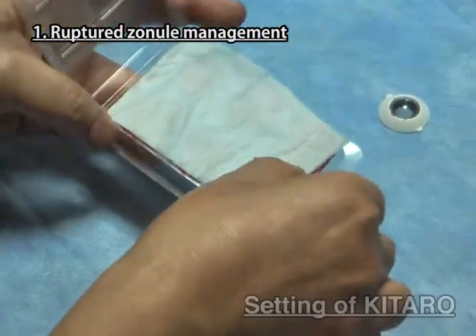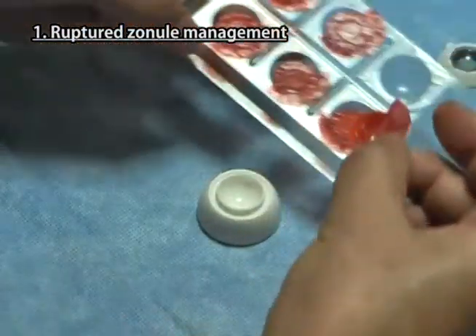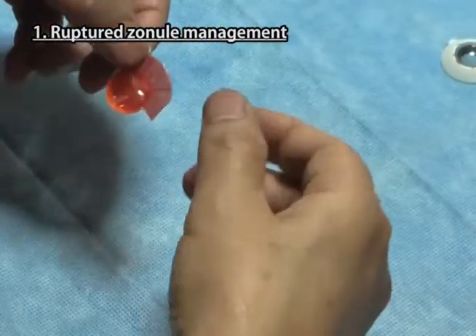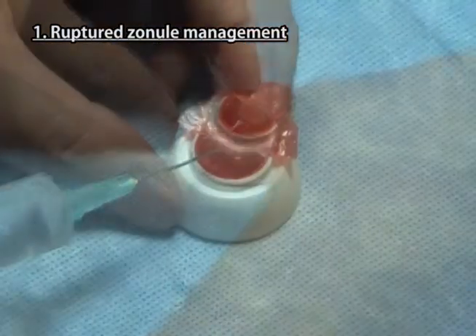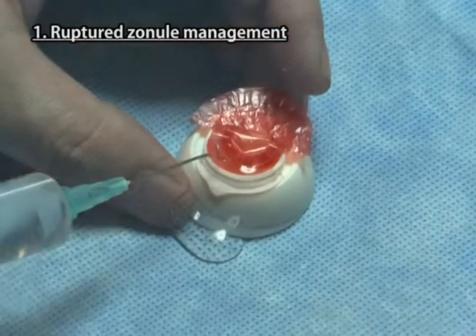Take the case of six cataract lenses with 180 degrees missing zonules from the aluminum pack and take one lens from it. Put this lens in the hollow of the sclera part. Inject a sufficient volume of water or viscoelastic under the lens through the space of missing zonules.